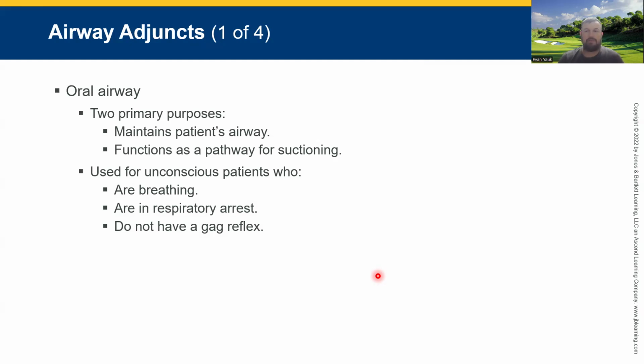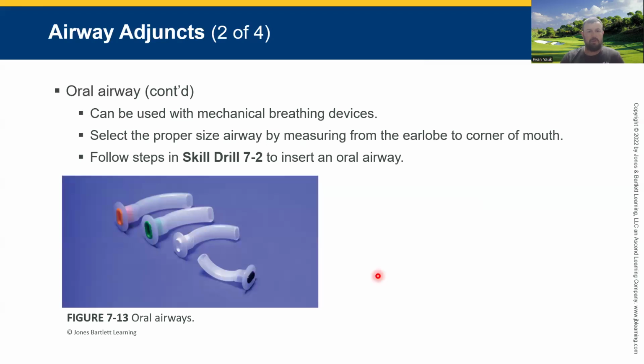So if you put in an oral airway, and oral is mouth, right, and they gag, you must remove it. You can't just keep putting it in there and go, oh, I'm going to use a smaller size, which we're going to talk about sizing in a minute. If they start gagging, you have got to find a different route. So this is an oral airway, or an OPA.